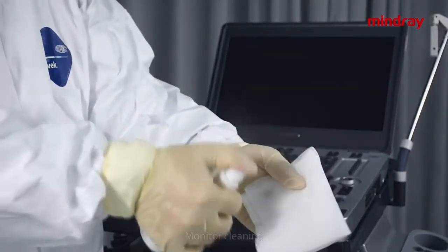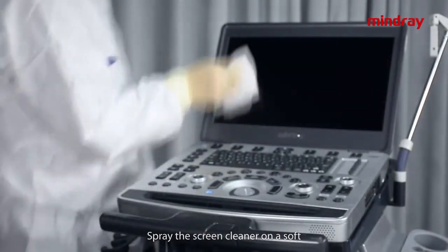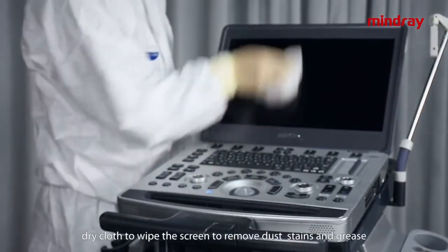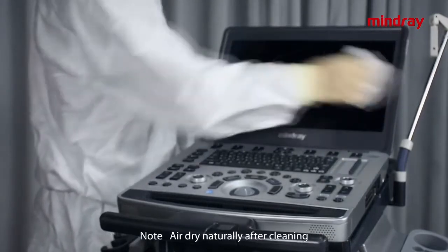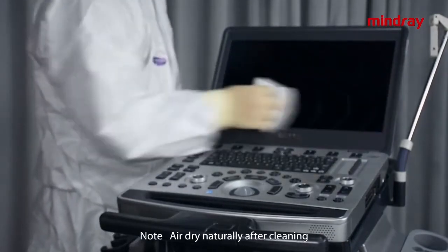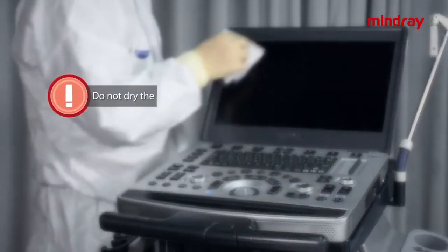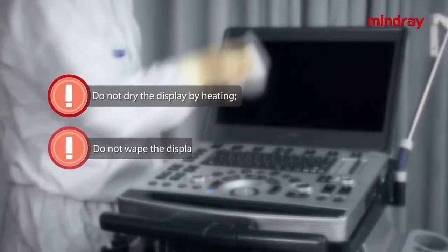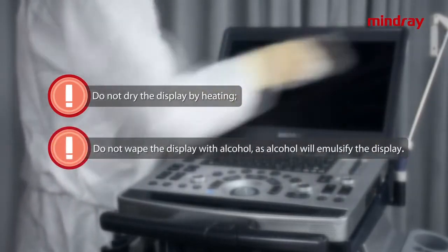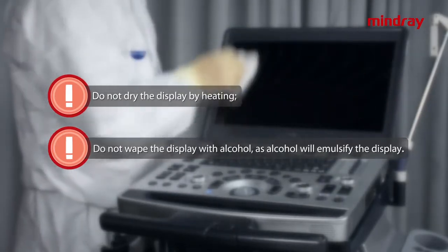Monitor cleaning. Spray the screen cleaner on a soft, dry cloth to wipe out the screen to remove dust, stain, and grease. Note: air dry naturally after cleaning. Do not dry the display by heating. Do not wipe the display with alcohol, as alcohol will emulsify the display.